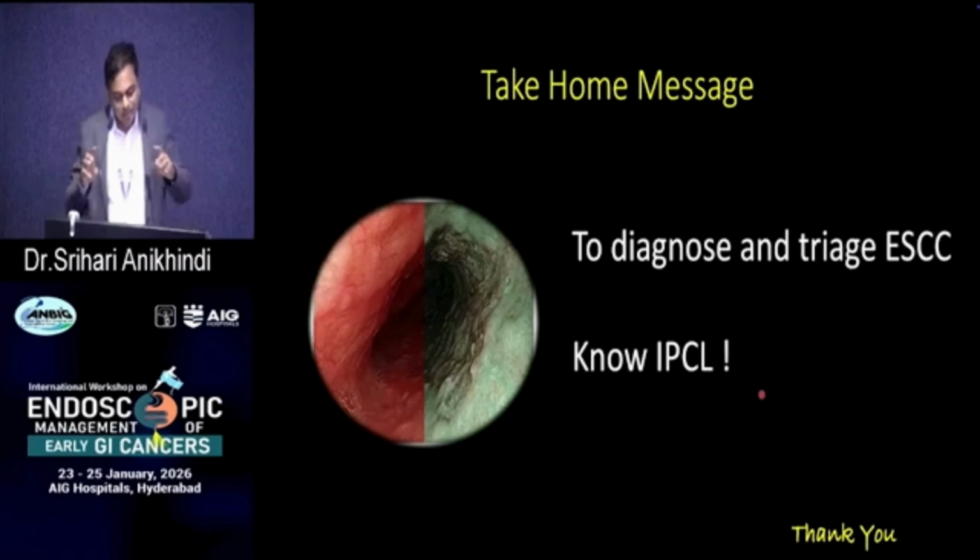So ladies and gentlemen, I think the take-home message from this should be that to diagnose and triage early esophageal squamous cell carcinomas effectively, we all need to understand and know the IPCL patterns.